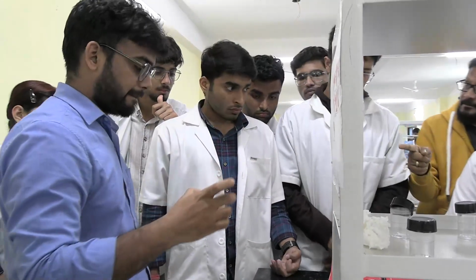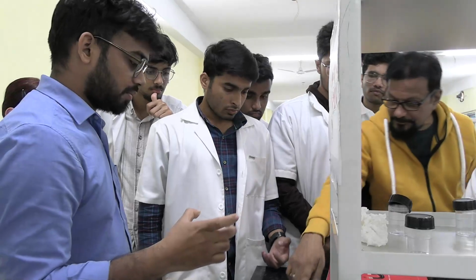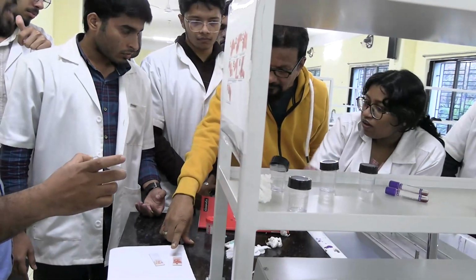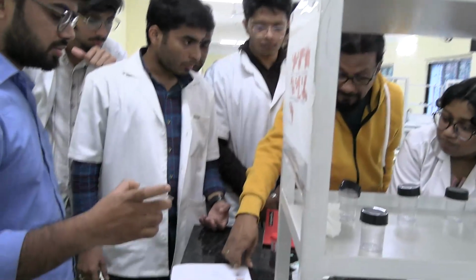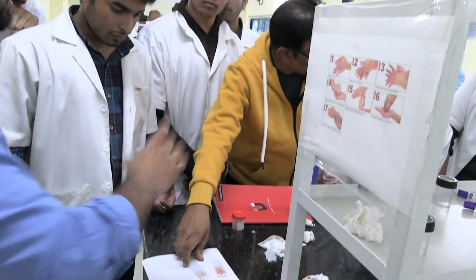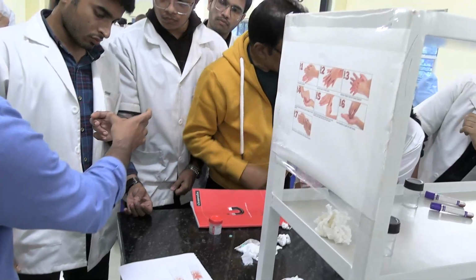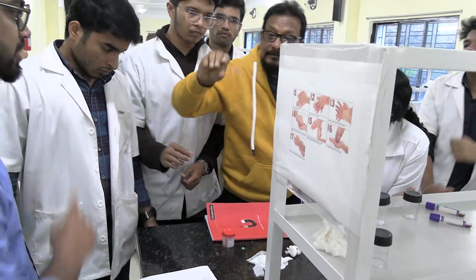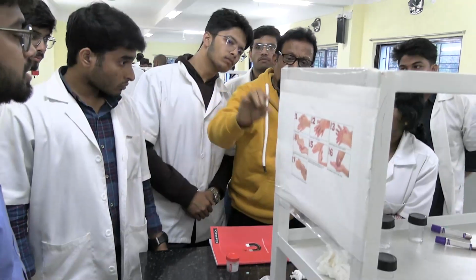They have experienced it, no? Why did it happen? There are impurities, and the slide was not clean. The surface is greasy. Here is the same. But you see this? Blood flows in, and the slide is perfect. Yeah, this one is very good.